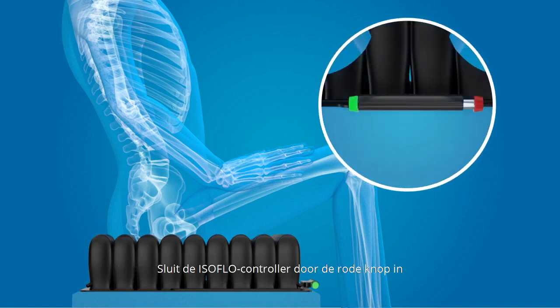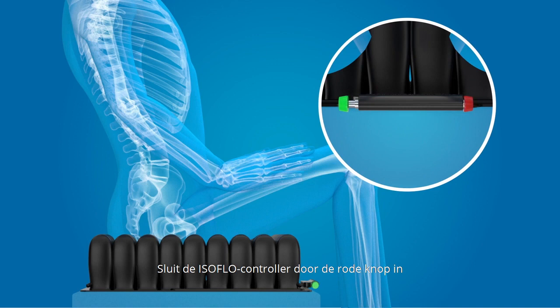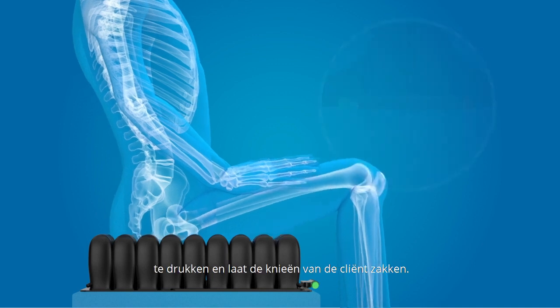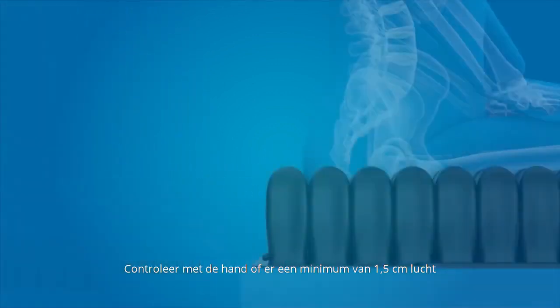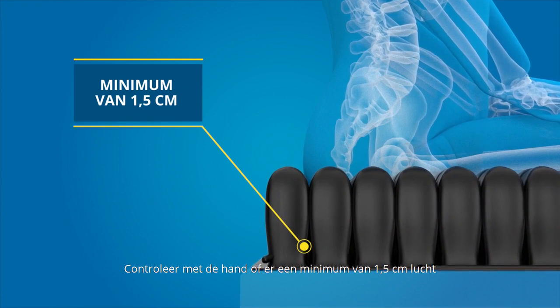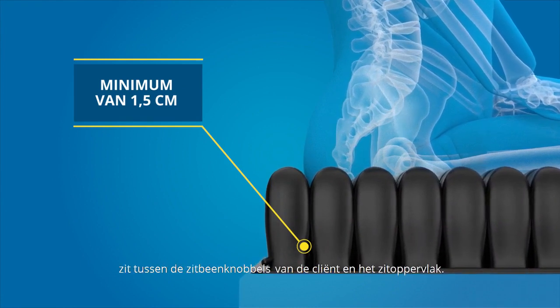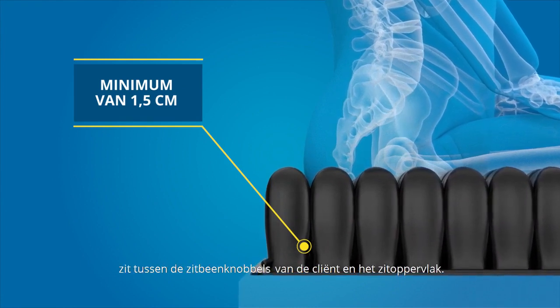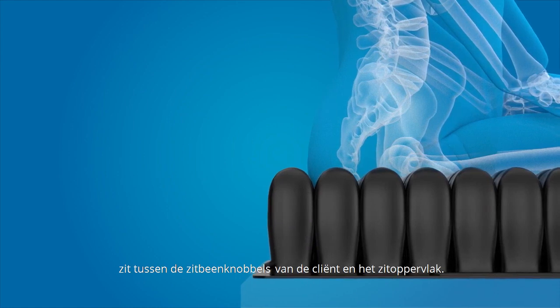Close the isoflow control by pressing the red knob in and lower the client's knees. Perform a hand check to ensure there is a minimum of one-half inch of air between the client's ischial tuberosities and the seat surface.